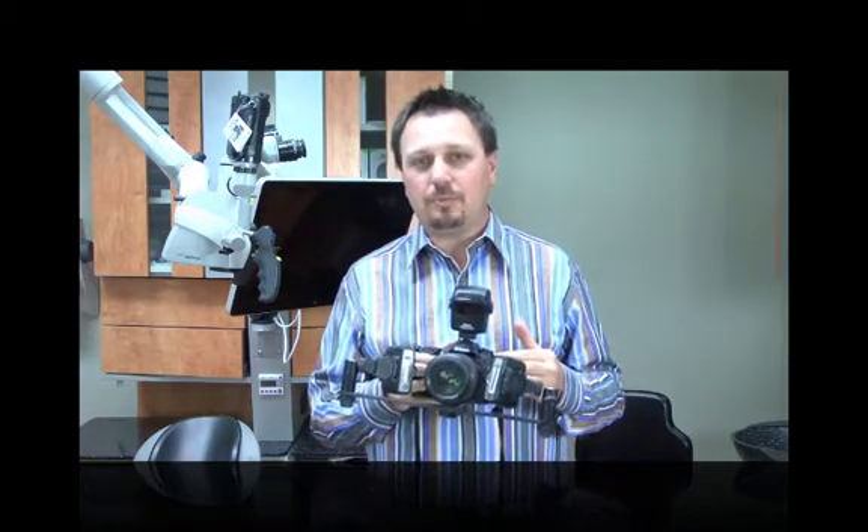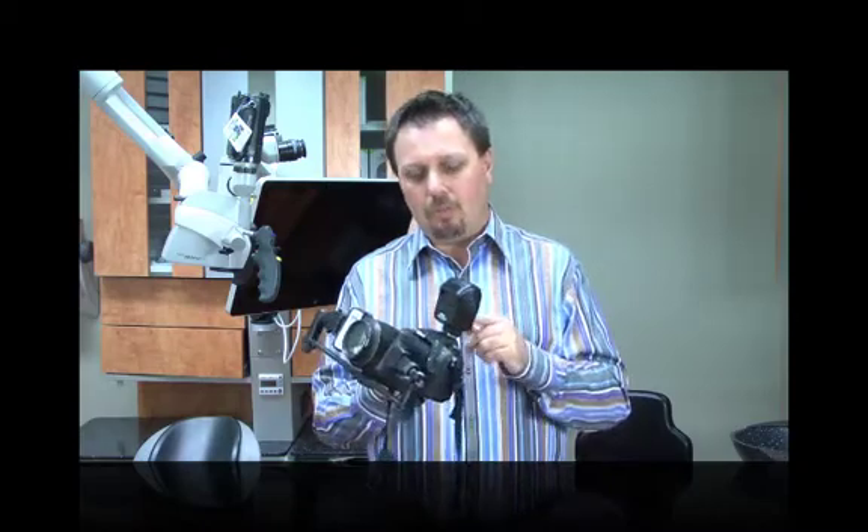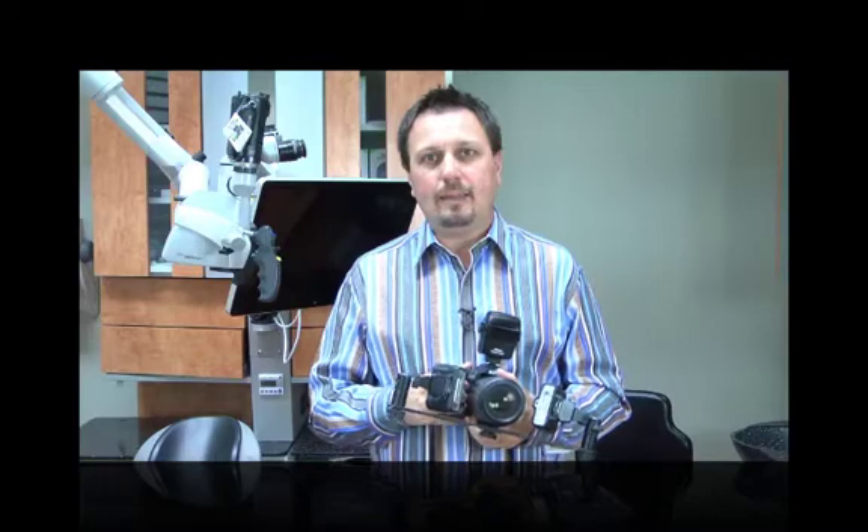Another neat feature is 1080p video at 24 frames per second with full-time autofocus, which is excellent and fairly easy to use compared to the D3s, which does video but lacks full-time autofocus. It also has stereo audio, though if you plan to do a lot of video on a digital SLR, you'll want to buy a microphone for the hot shoe adapter. Those are the key features I found intriguing when looking to buy my wife a new camera.